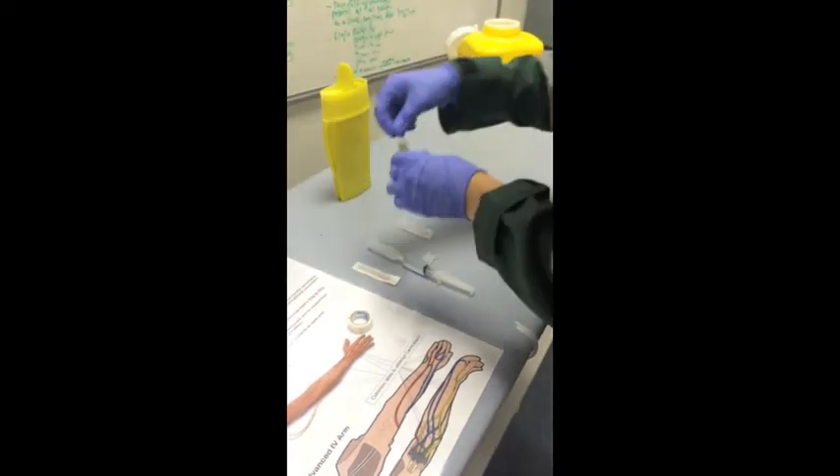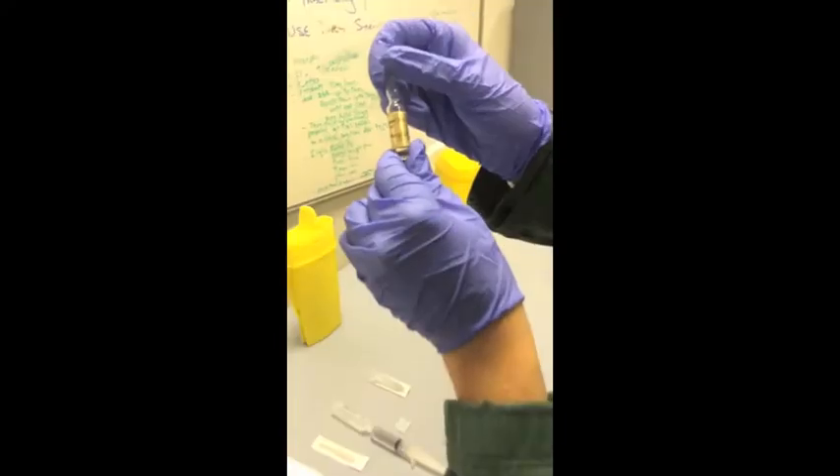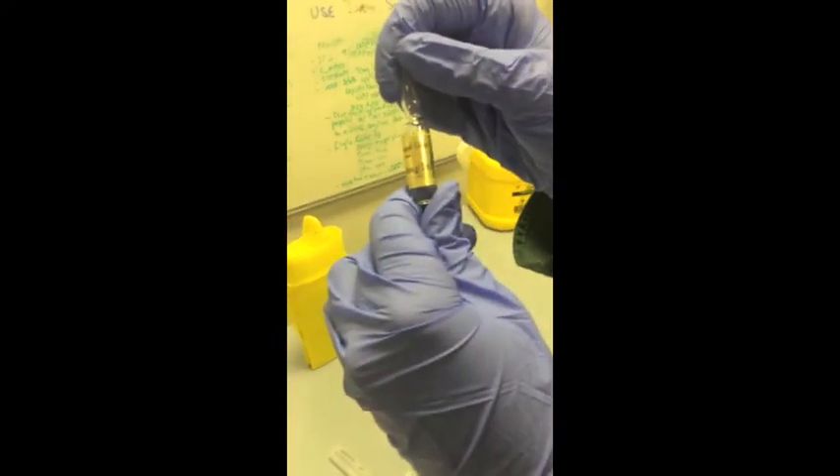I then check the medication: 100mcg of fentanyl in 2ml, with the expiry in 2019.